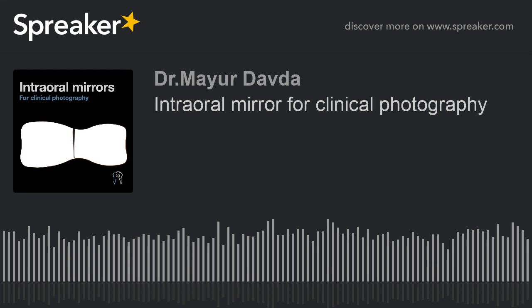Sometimes the region that we want to document is very distal, and the approach to that subject is very, very difficult to obtain. Even in certain cases like these, we have to use an intraoral mirror. So, what are the different criteria that make a mirror an ideal mirror for intraoral photography? Let us have a look.